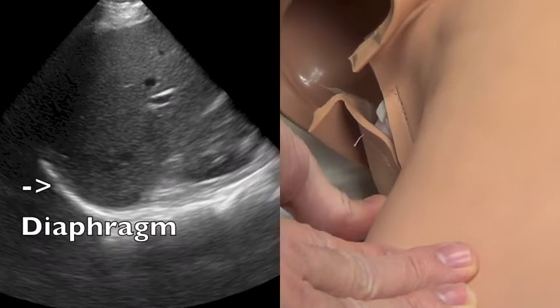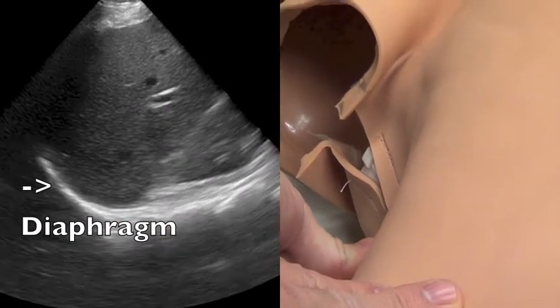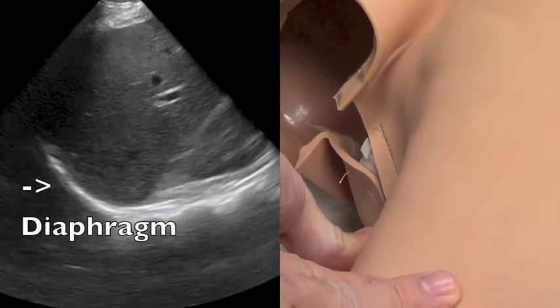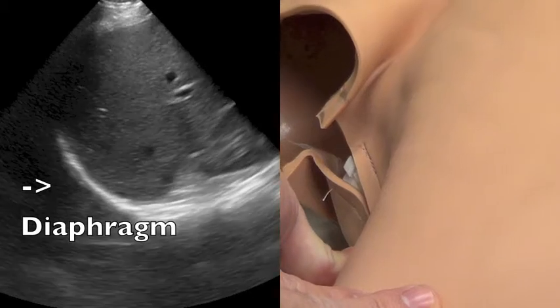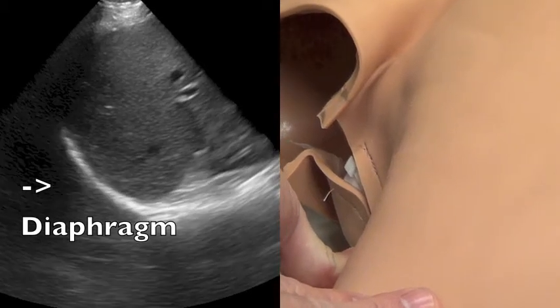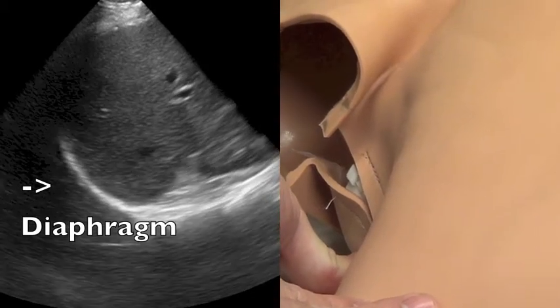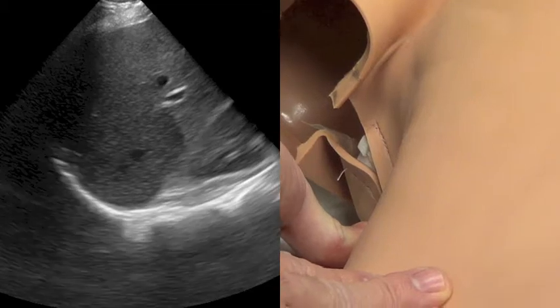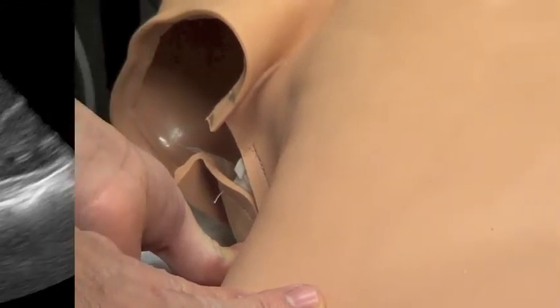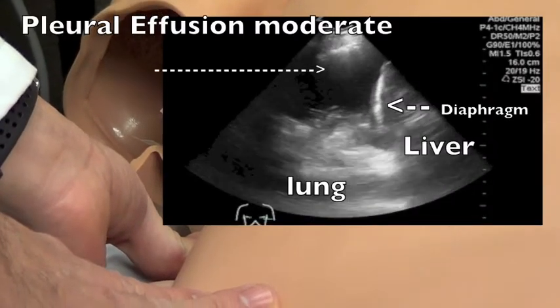You will actually be able to see the apposition of the hepatic silhouette with the diaphragm by ultrasonography. And just superior to that, we should be able to identify the effusion.